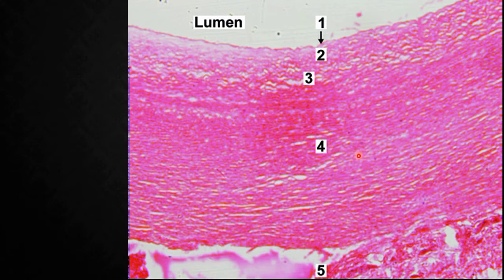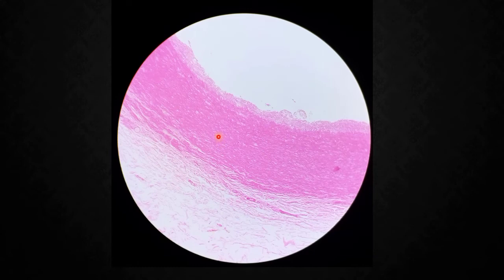These are all the elastic fibers, and the laminae which you can identify here are the internal elastic lamina, and outside will be the external elastic lamina. Let me show you the histology. Yes, here you can identify. This is nothing but the endothelium, and here you can see the differentiation between the endothelium and the tunica media, between the two layers, tunica intima and tunica media. Here you can identify a lamina. That lamina is nothing but the internal elastic lamina. Then outside we can identify another lamina, that is the external elastic lamina.